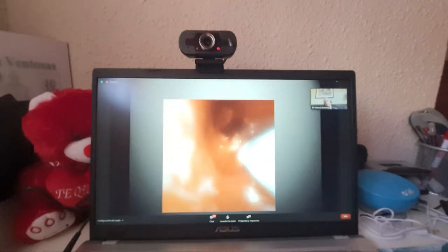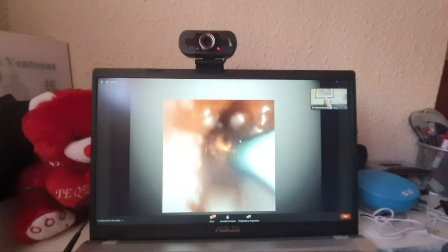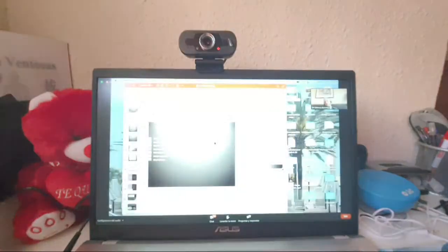the public's fickle taste. So finally, this is off license again, the Boston Scientific scope, just doing some electric cautery with this. Again, off license, but it is feasible to do argon plasma with this. So thank you. I'll finish there. Thank you.